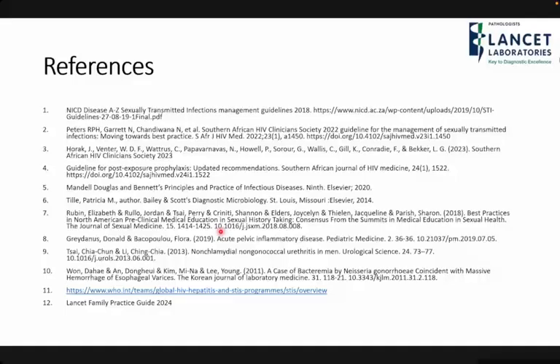Yeah, multiplex is the same process, but with multiplex you have multiple targets, so you have multiple extractions of different organisms happening at the same time in one. So say this patient has a vaginal discharge syndrome. I don't even want to stress about what is causing this, but I know the commonest causes are these. And so there is a test for all the commonest causes. So we get one sample, and we don't ask for multiple samples, as opposed to maybe when you want to do syphilis or something else. So we get one sample.